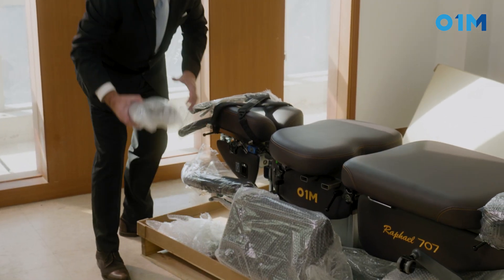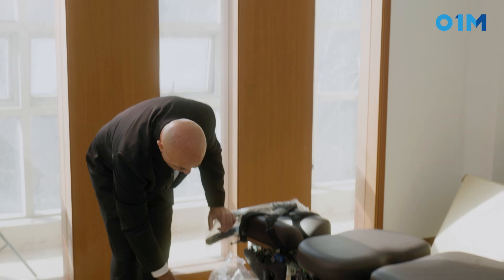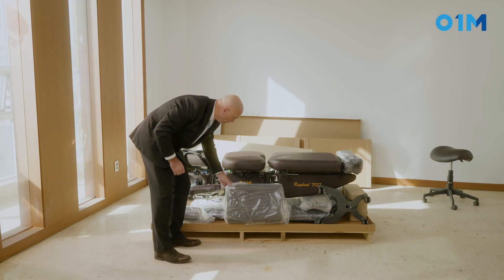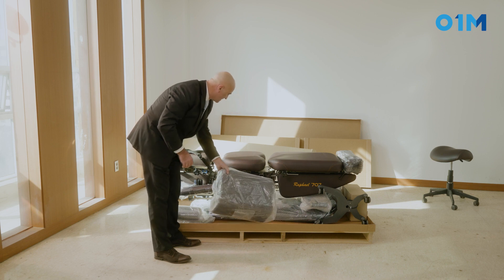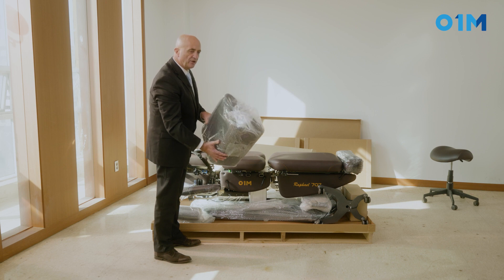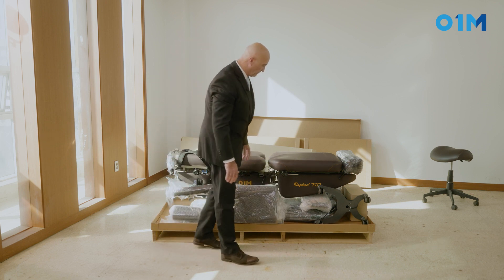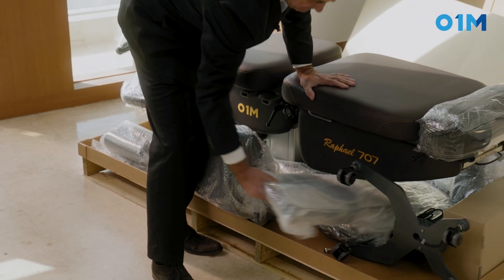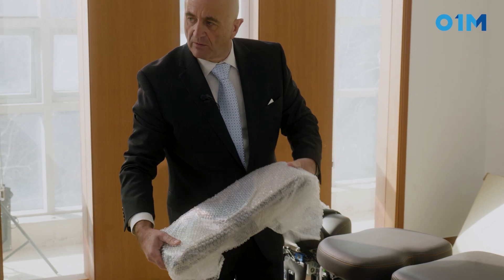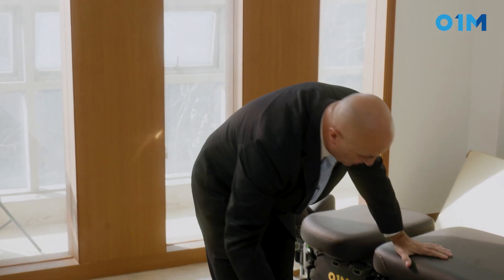Here you have the roll, the axillary rolls. You have the stiff metal piece to fix the axillary roll beside it. This is basically the leg support when you're supine on the table. Right here you have all the brackets that go for the decompression unit.